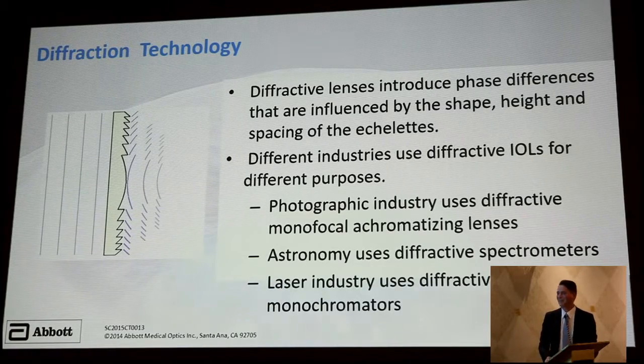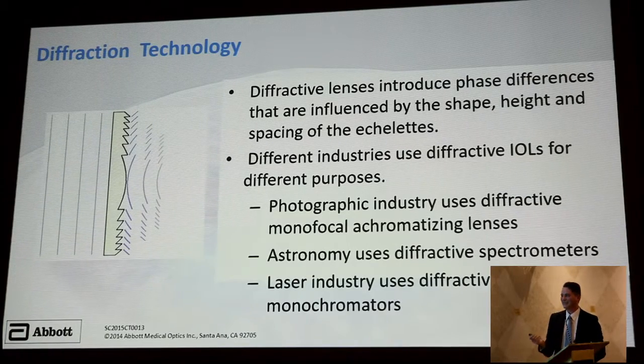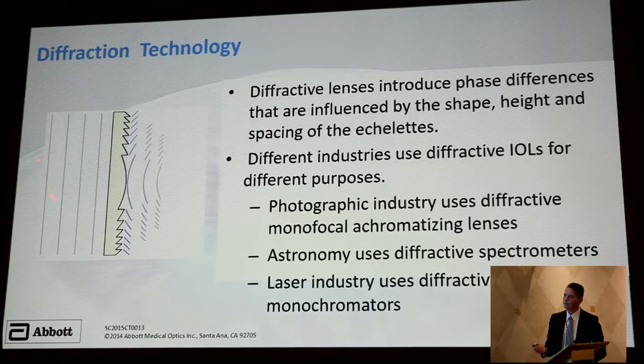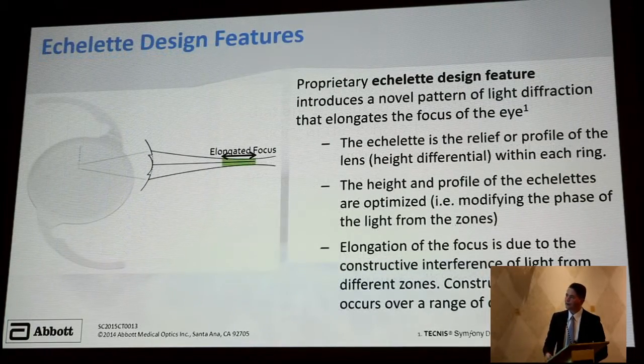Correct? There is more physics if you'd really like me to show you the math behind it, but essentially, that's what it's doing. And it's used in numerous industries, but this is really novel in lens design. I believe it's a Canadian engineer that did it, so kudos to Canada for that. So that elongated focus is here. Instead of a point and then a second point, you're getting this focus between these 2 points. And that's where your patient satisfaction comes from.